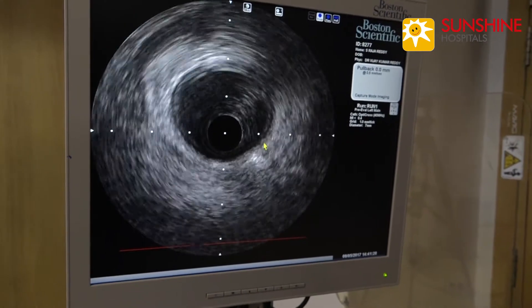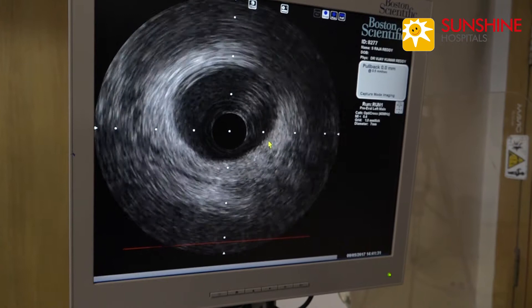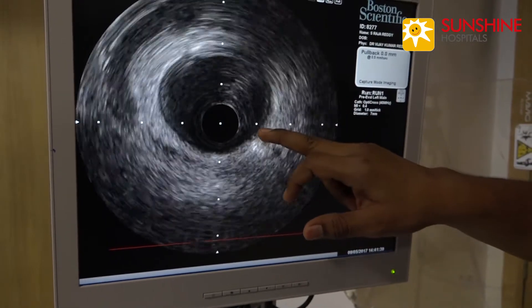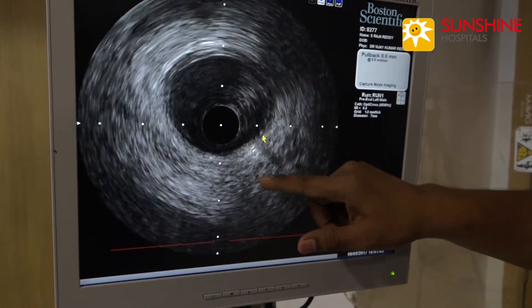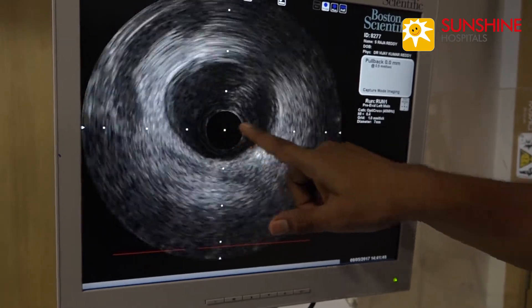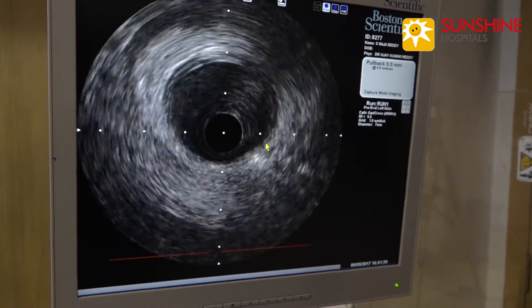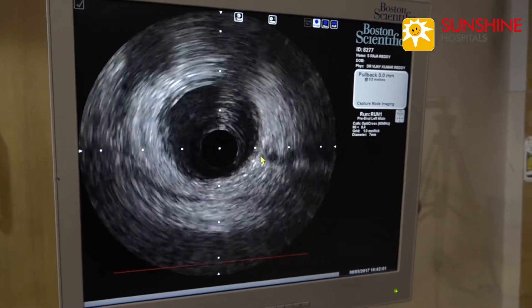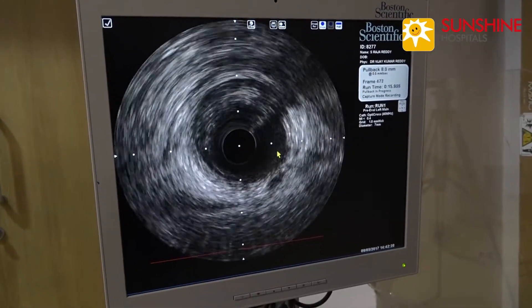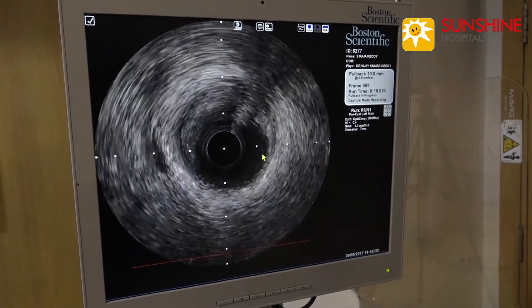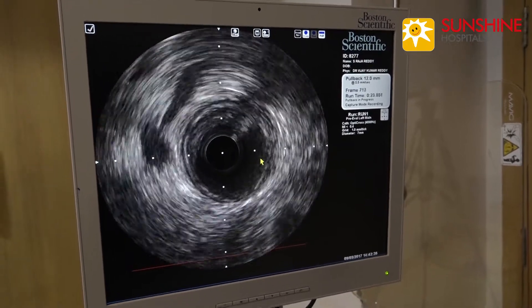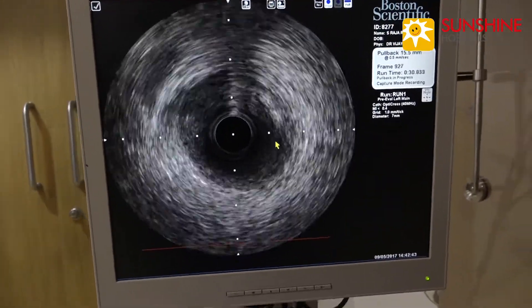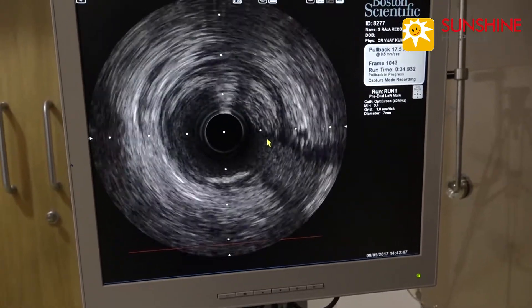Now we are withdrawing the IVUS catheter by motorized drive at a speed of 0.5 mm per second, coming from the distal LAD approximately into the left main. There is some black structure — there is a venous system; you are able to see the oblique sinus. Here is the left main bifurcation. We are seeing the circumflex artery and the LAD.